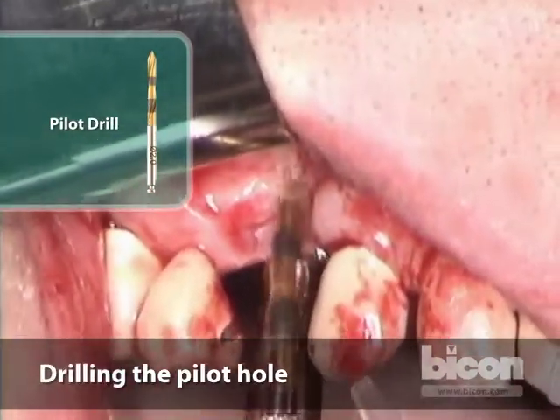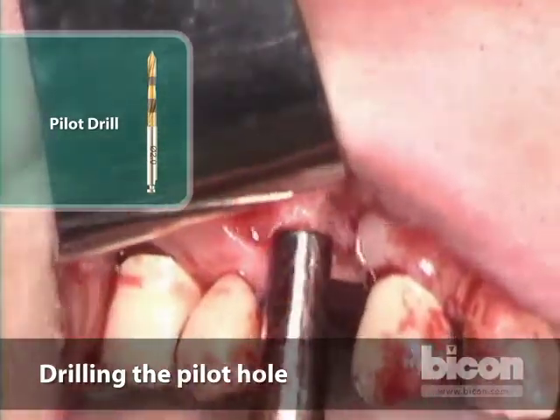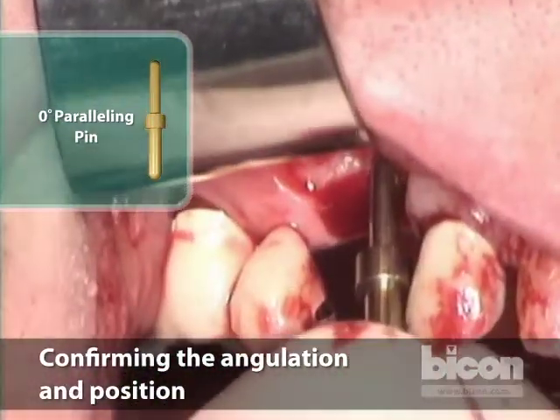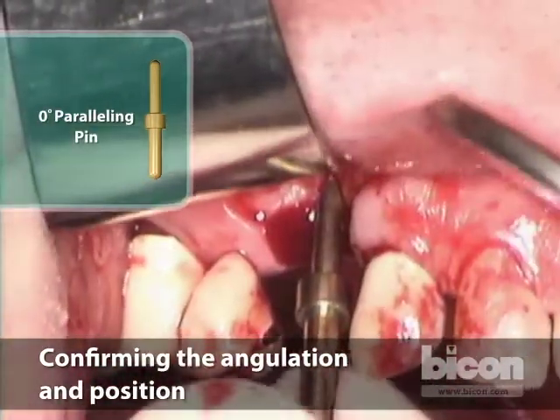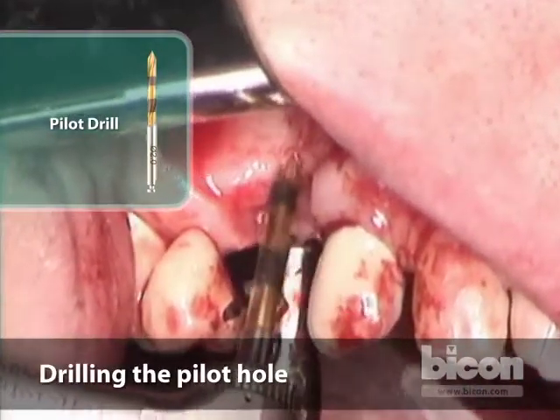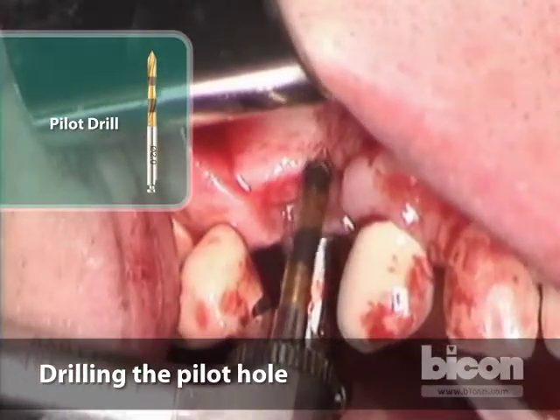So before we go too far, we will make our initial perforation about 3 millimeters or so. We check the location and the angulation. So this is pretty angled this way. So we have to fix that angulation right off, right? Okay, and now our osteotomy is at a 6 millimeter depth.